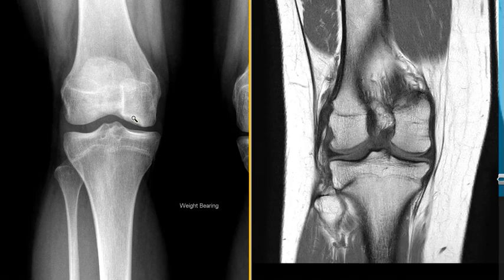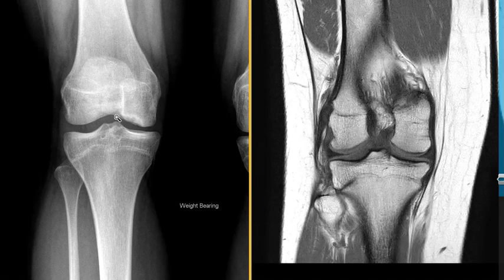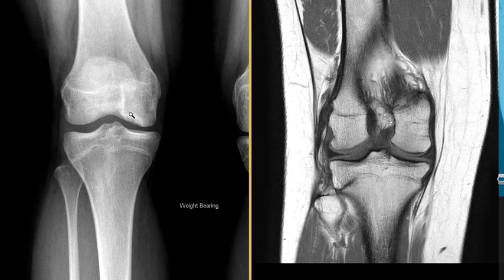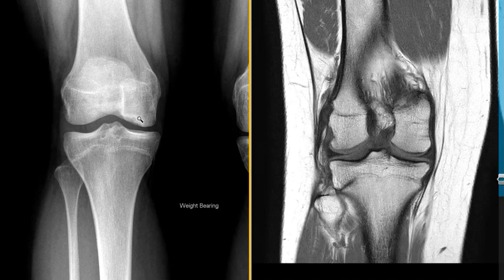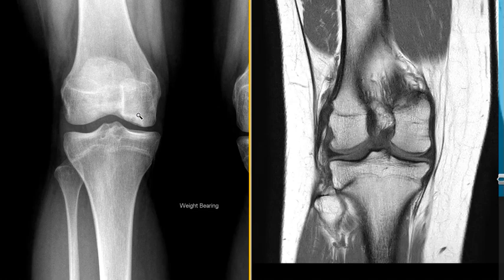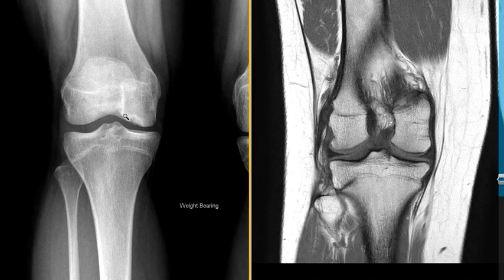The defect of the bone and articular cartilage — it's not terribly uncommon. We see this in kids; it usually involves the medial femoral condyle along the outer side and goes into the intercondylar notch. This is just a really classic appearance of what we call osteochondritis dissecans. This osteochondral defect happens in kids and it usually will heal spontaneously.